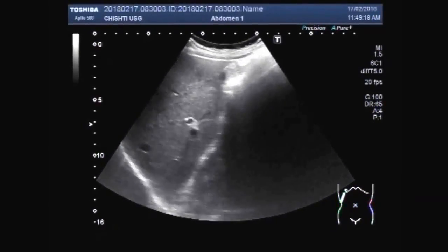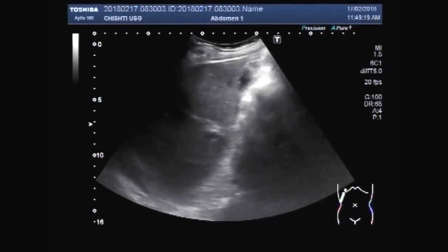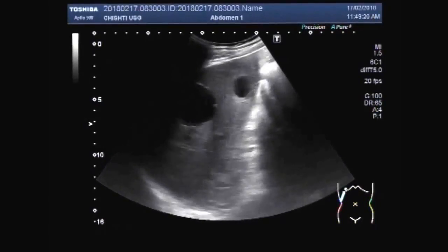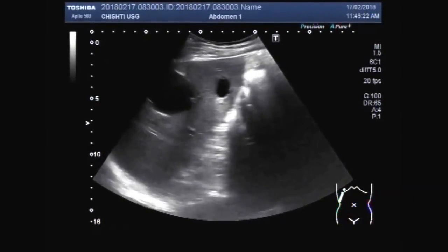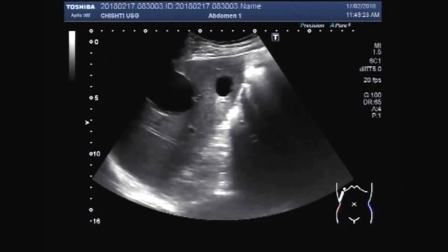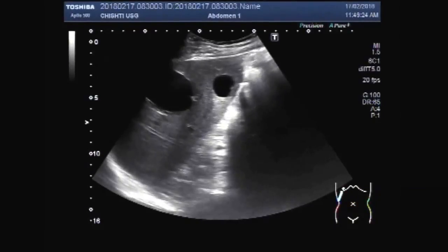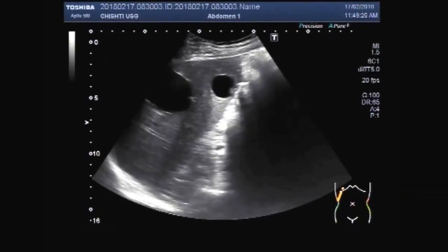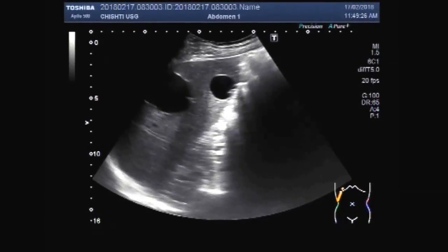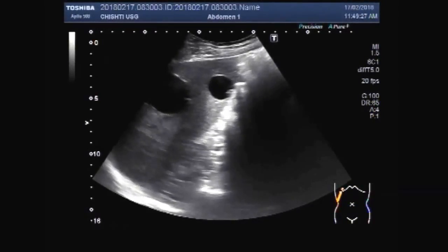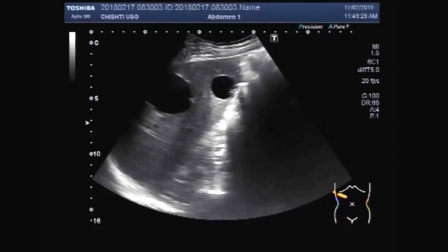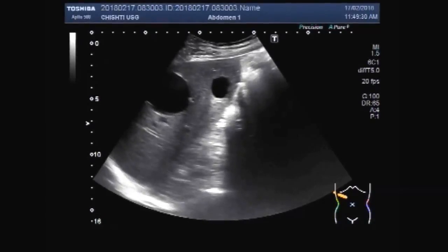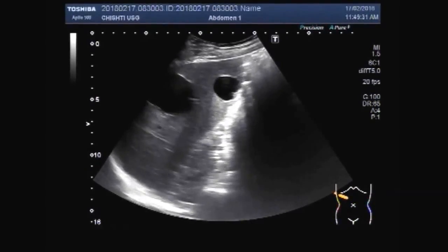Now, these are the two hydatid cysts seen in the upper and middle portion of the right lobe of the liver.